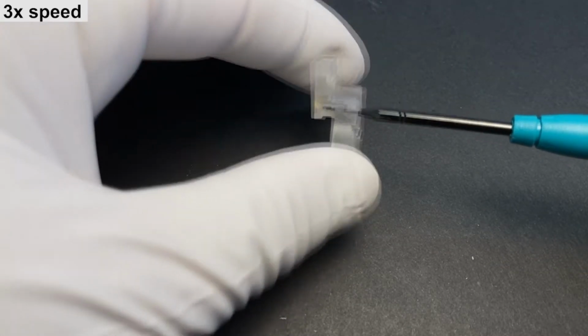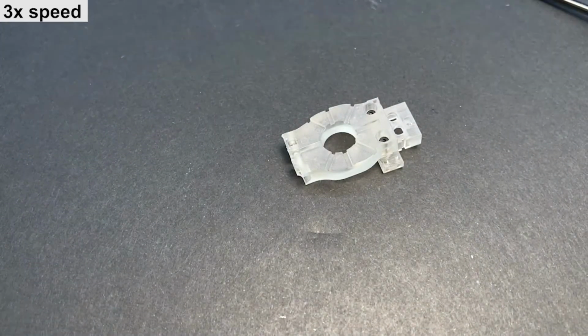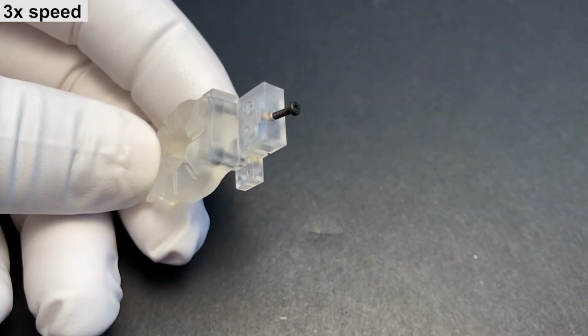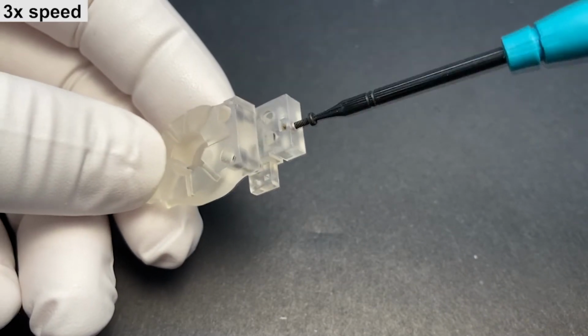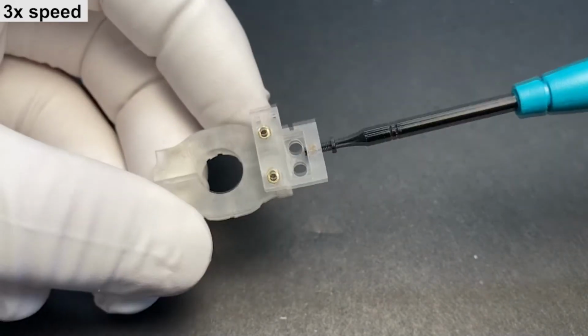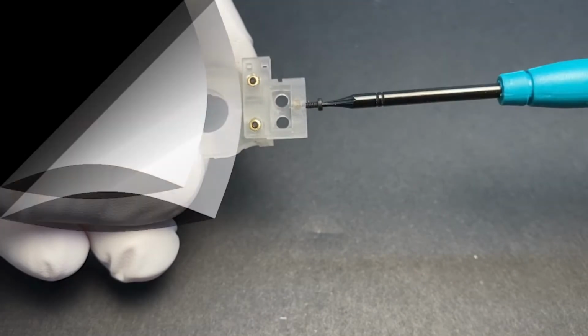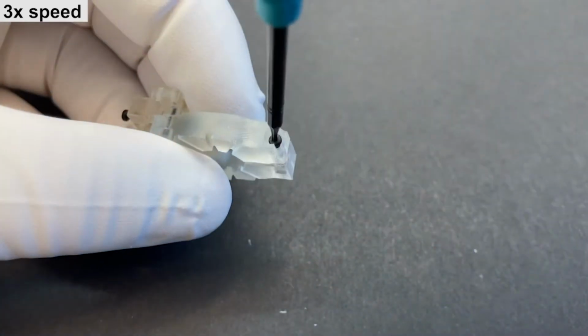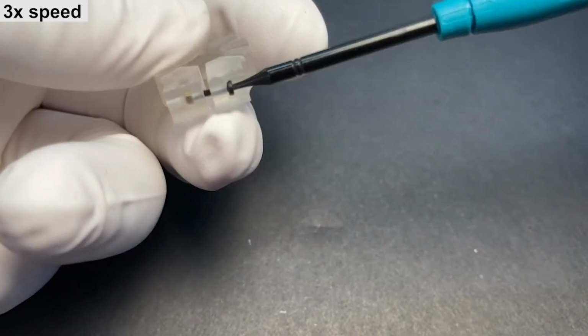And then we also insert other screws into both of these components. This screw will hold the head of the drive in place. And this screw mechanism will be used to lock in this component or attach this component to the stereotactic arm.